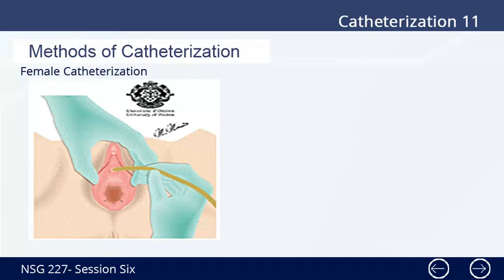8. Drape so that only the perineum is exposed. It protects the bed from soiling. 9. Position light source directly on the exposed area. Prepares equipment for later use. 10. Open the sterile catheterization pack on the tray using sterile techniques. Placement of equipment on the working area increases efficiency.